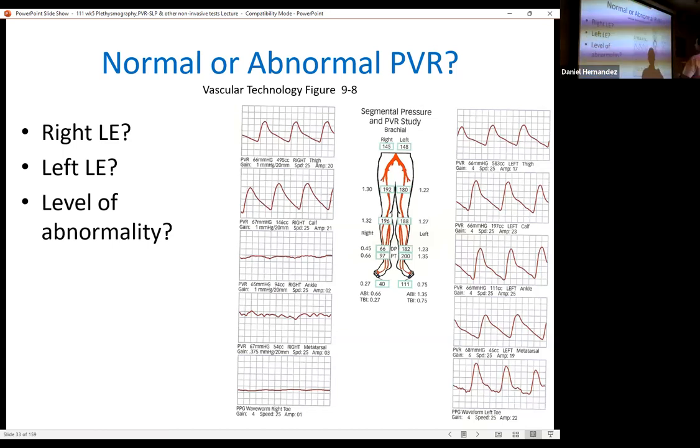So they're only doing a 3 cuff method. I was just thinking one thigh cuff. So it's below the ankle, below the knee then. There are 2 ankle cuffs, so it's getting your dorsalis pedis pressure and your posterior tibial pressure. So it's really only one cuff, but you're taking 2 pressures with that. We're going to see the pressures in a moment. So it's below the knee.